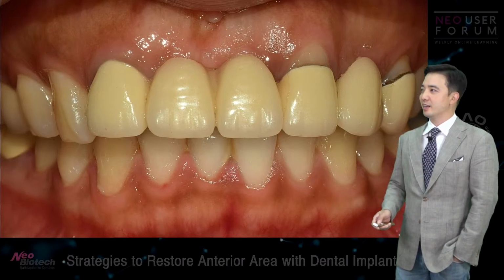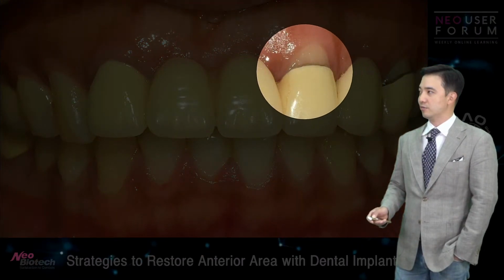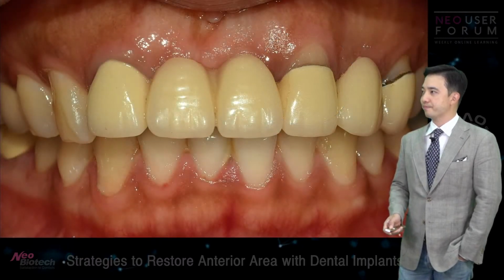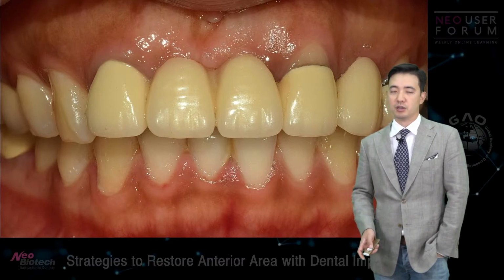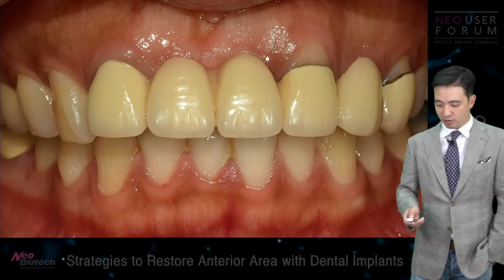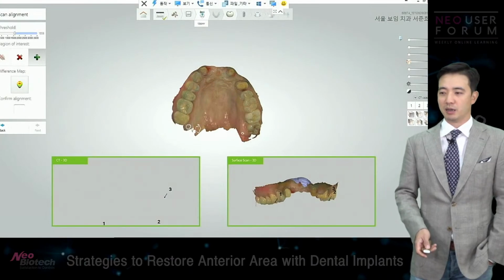And as you look at here, there's a marked recession on number 22 area. I thought I already knew this was going to be a challenge, but I just took the bullet and said, okay, let's do this. I'll try my best, and we can make this happen.